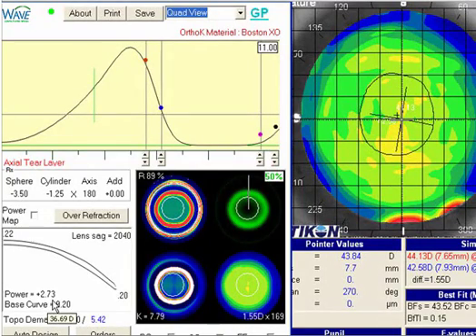So I can leave that just where it is. If we needed to adjust that, we would simply click up or down under the red dot until we reached our appropriate power. Since we were aiming for about a 270, I'll leave it right there.